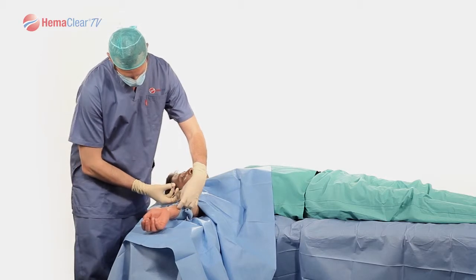Your tourniquet is now down. Note the tourniquet time. Thank you for tuning in to this Hemoclear training segment. If you have any questions on the reviewed material, please contact us or your local product specialist.